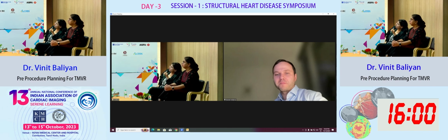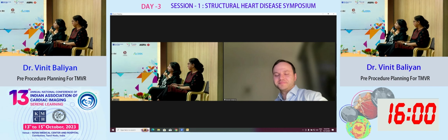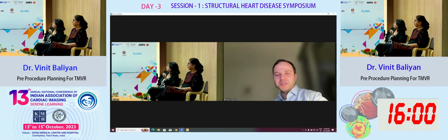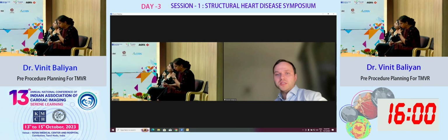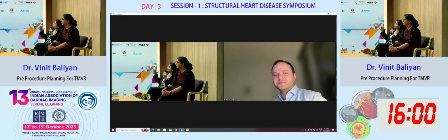Actually, in my experience, my cardiologists normally request an MR. So we normally do the rims on the MR. And how do you feel about it? Sure, if you have a good sequence, maybe a good 3D sequence, and maybe good SSFP images where you can see it nicely, then it's fine. Because we definitely need to pre-decide how we're going to get it. So definitely it's a lot more effort. But the fact that we get it in systole and diastole, and we get a moving image of the ASD, just makes it more accurate.